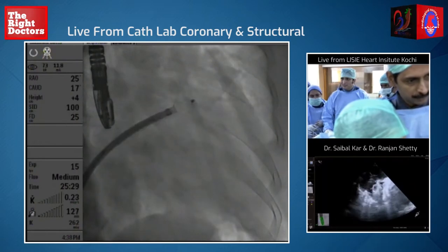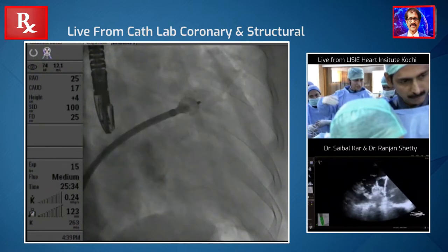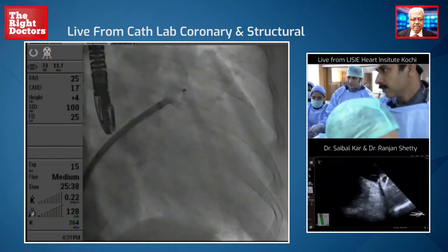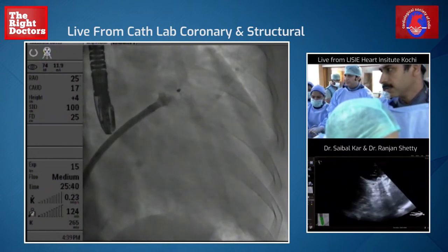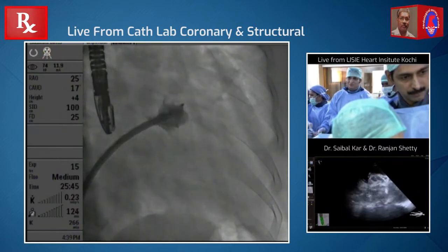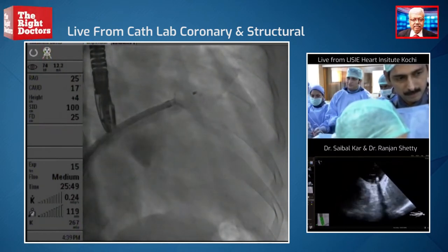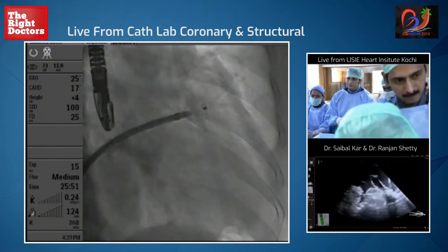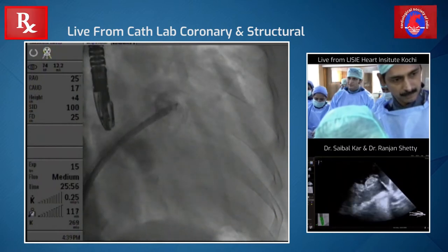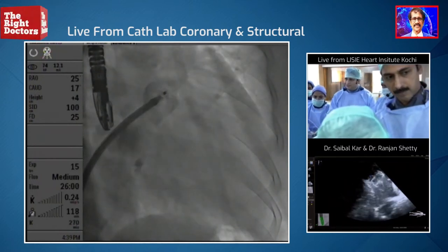Test here — which is nice. Still in and good in. So maybe we need to start a little more outside — we're going to go deeper inside and get a 22 device. This device I think is a little big — but it's okay, that's not a problem. Maybe we should sandwich it — and that's also a little bit proximal, but it's actually not bad.